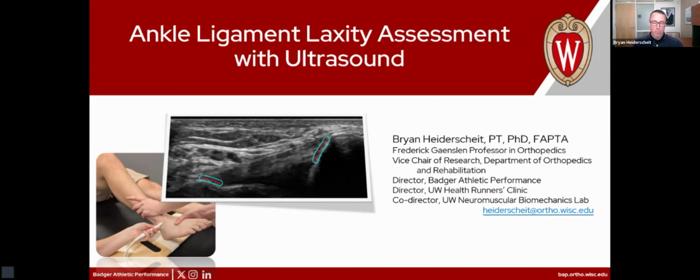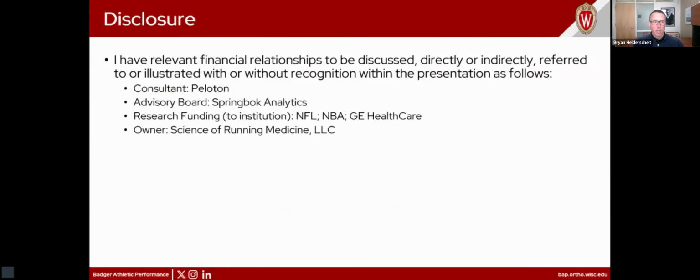So today's webinar really is designed around how we can utilize that ultrasound imaging at the point of care, as I mentioned, or in a clinic setting, where we can get a better understanding of both the prognosis and plan of care for these injuries. Quick disclosure slide.